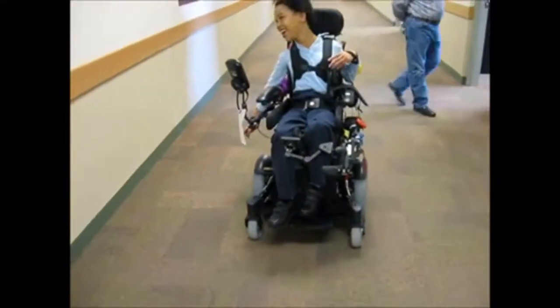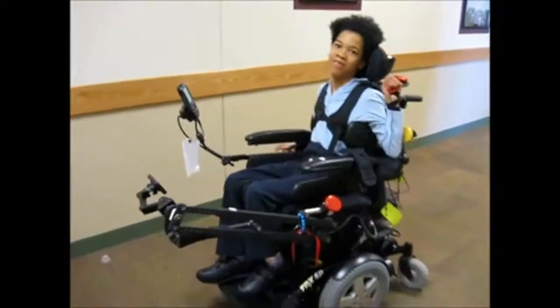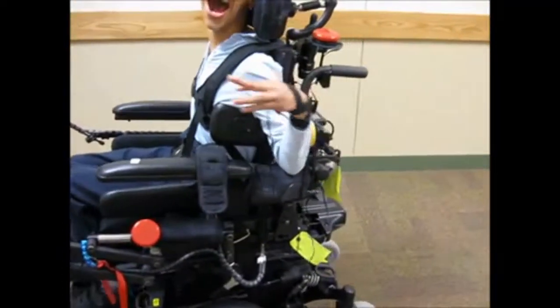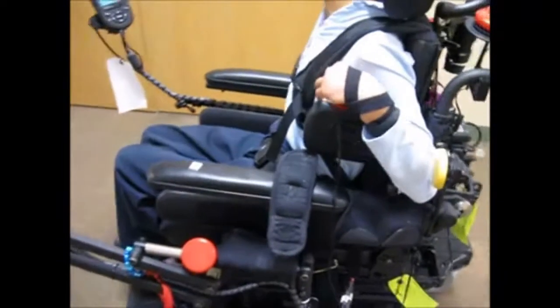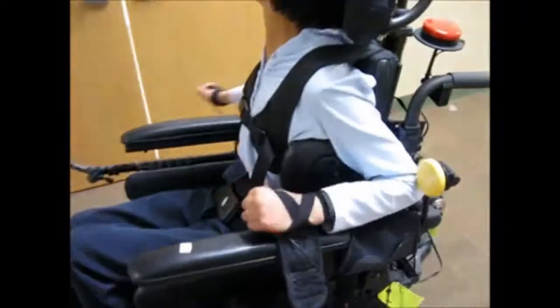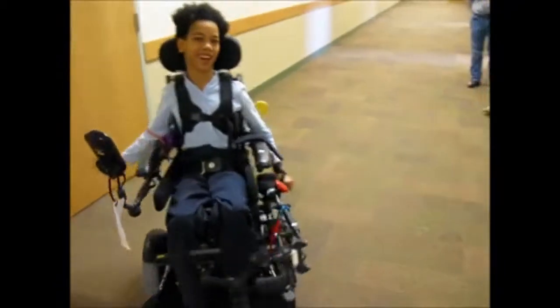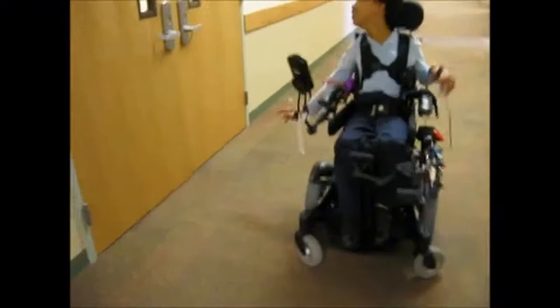All right, this is Faith driving. She's got her forward switch behind her left arm that she's pushing right now to go straight ahead. And she's got a switch in her left hand for left turns. Can you show us a left turn, Faith? Yeah. There you go. Good job. And she's got the switch in her right hand for right turns.